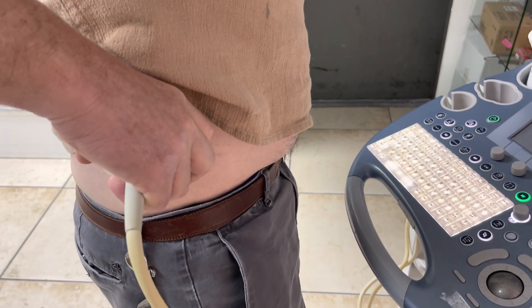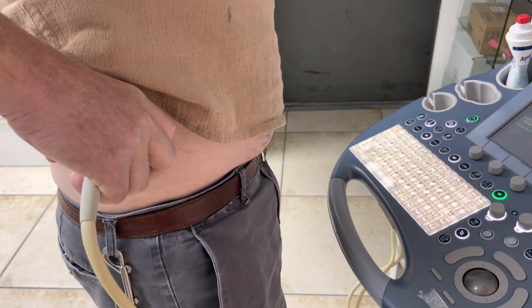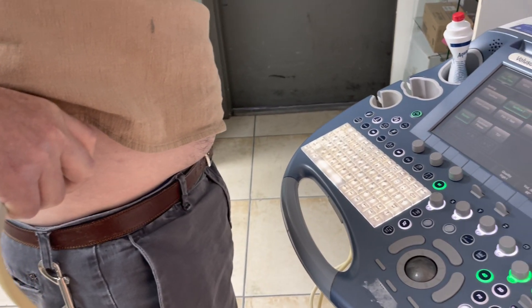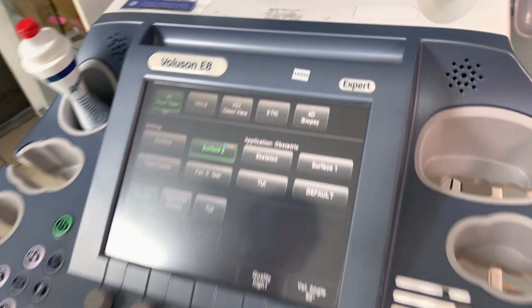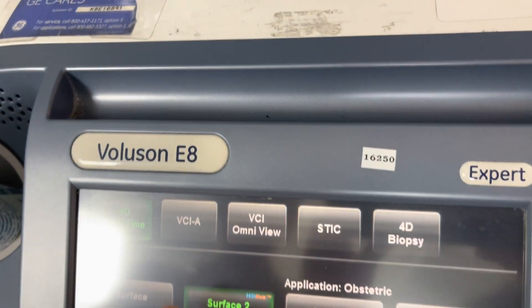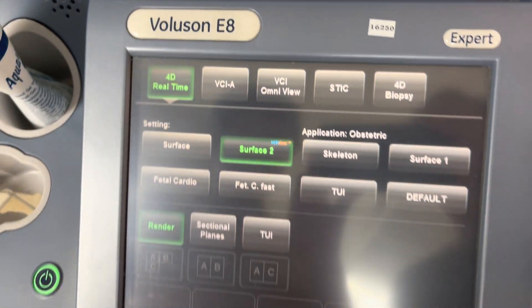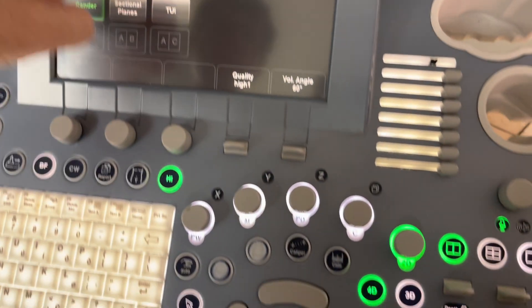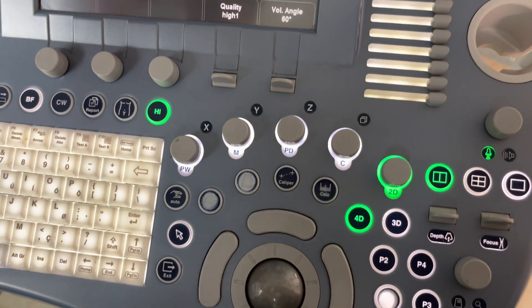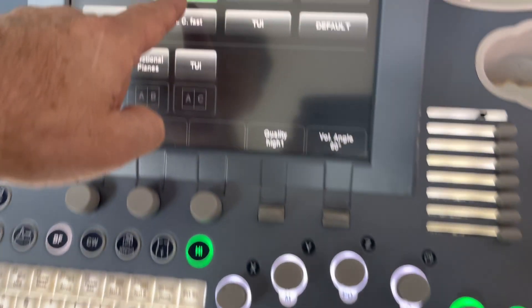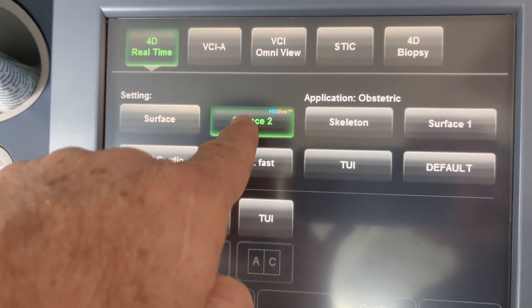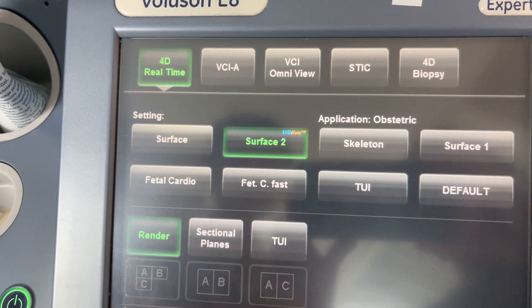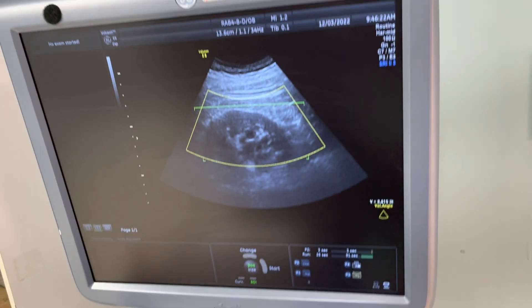In HD Live, I have my kidney and I have the 4D selected for real-time 3D. I'm going to choose Surface 2 HD Live and now I start doing the configuration.